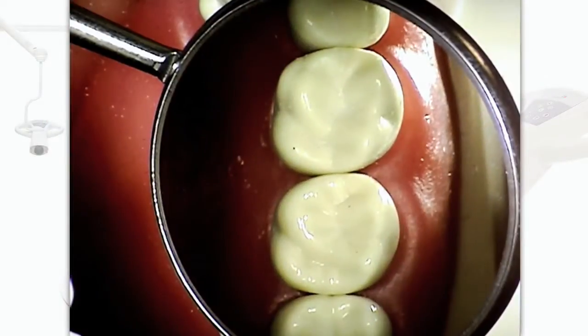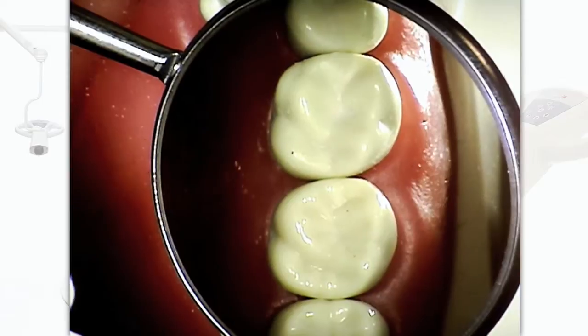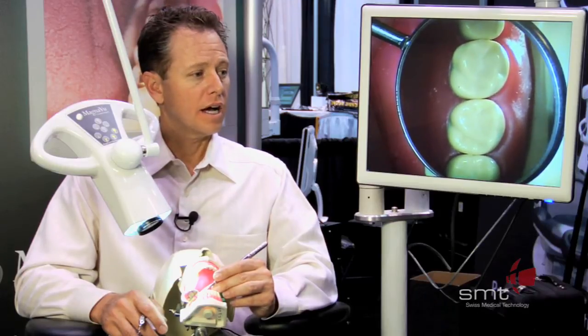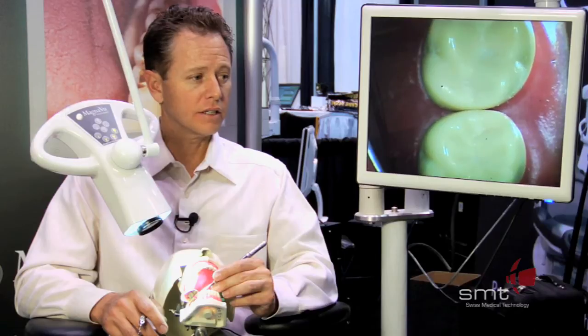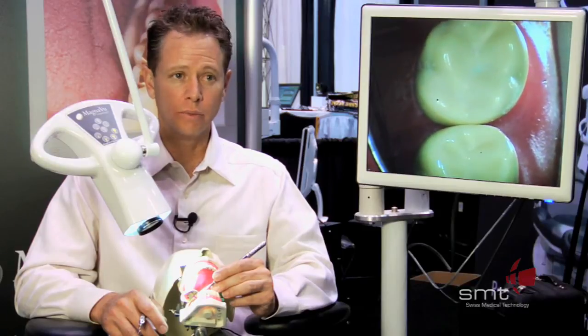The advantages of the Dentaloscope 2D are, first of all, ease of use. It's very simple, very quick to set up. Within 15 seconds you can have it set up to work on any tooth in the mouth. Secondly, I'm able to sit upright and work off of the screen so I don't have to look down — I don't have any of that neck and shoulder pain that we get from using loops. I'm able to zoom in up to 24 power, and it also has very bright LED lights that don't emit any heat but really illuminate the mouth.